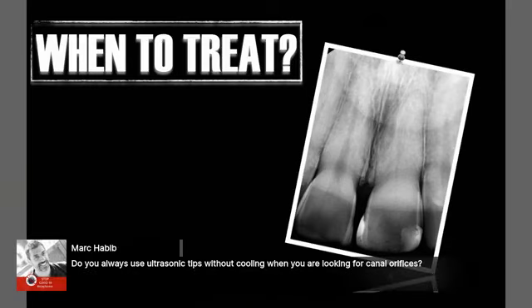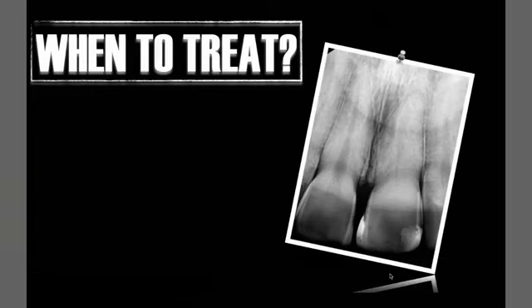Any other question? Yes, about whether you are using ultrasonic tips without water or not during the locating of calcified orifices. Yes, sure, I use the ultrasonic tips without water. Maybe you can put some drops of EDTA or sodium hypochlorite just to prevent the debris from blocking your view. But sure, you have to use it without water to enable you to see the colors more and see where you are cutting.